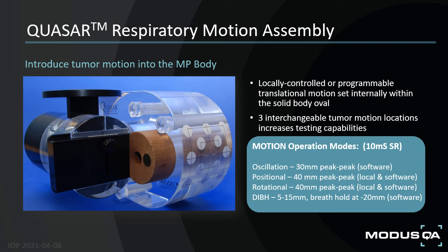This motion assembly is still equally capable of being locally controlled at the physical apparatus or programmable, in which patient-specific waveforms can be imported and then simulated within the actual software.